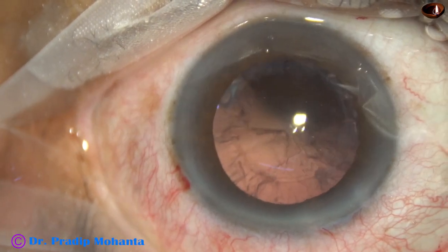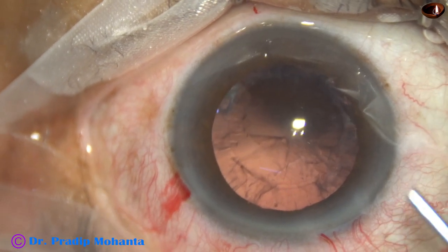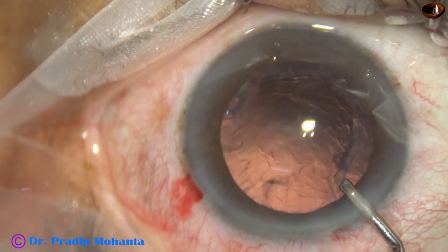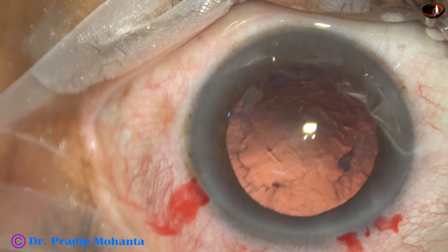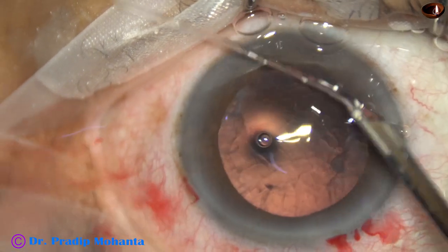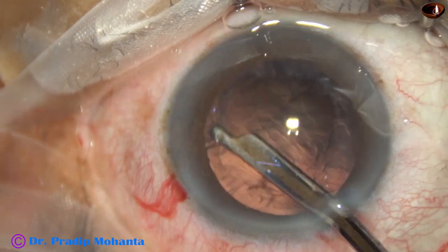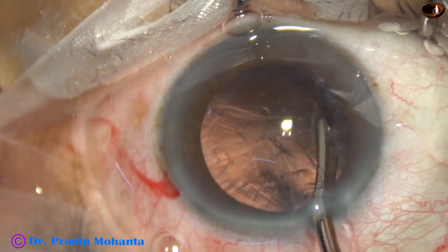The tip length of the pre-chopper is 1.7 mm; the tip length of the sustainer is 1.5 mm. It does not cause any stress on the posterior capsule — it does not even touch the posterior capsule. So this is a very safe instrument.